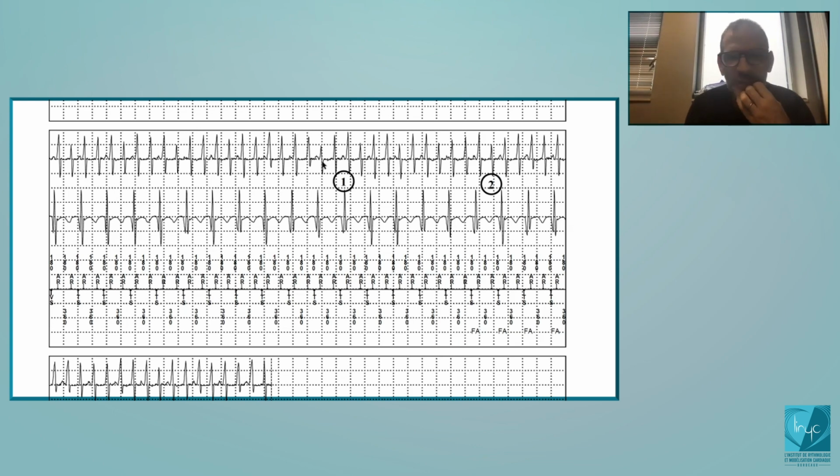In this case, that's not the case. You don't see long, short in the atrial sensing; the intervals are really stable, not a succession of long, short. So the second step is to say, okay, the atrial rate is faster than the ventricular rate, and the signals are real. It's not a question of oversensing. Then there is going to be a third step. So at this time, you say, okay, what are the possibilities now? The possibilities are conducted atrial fibrillation, conducted atrial flutter, or dual tachycardia.